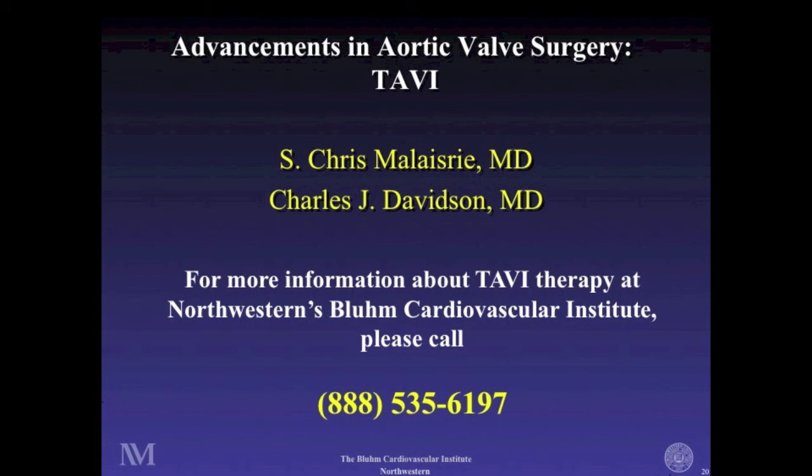Got it. And the next question is from Robin, and she writes in, I've heard that TAVI is performed with a surgeon and a cardiologist present, just in case something goes wrong during the operation. Is that true? Is it often that the TAVI procedures end up as an open heart procedure? Go ahead, Chris. So the procedures are done with both an interventional cardiologist and a cardiac surgeon as a team. That does not mean that open heart surgery is done because of that.